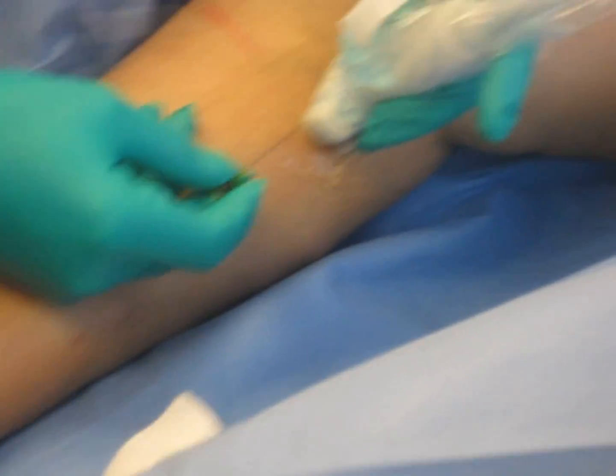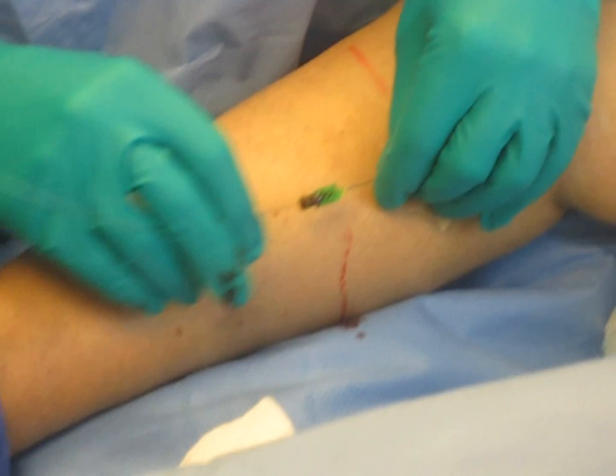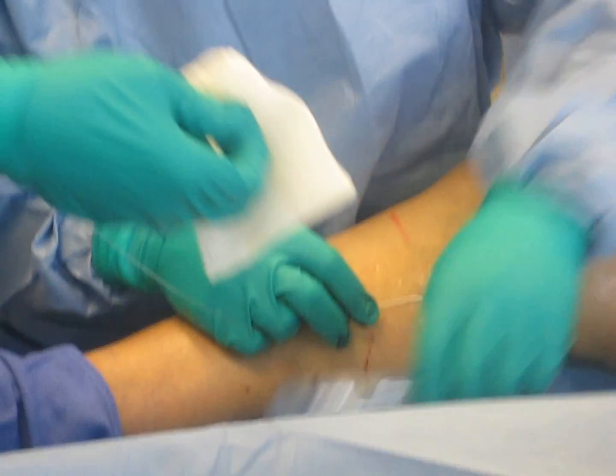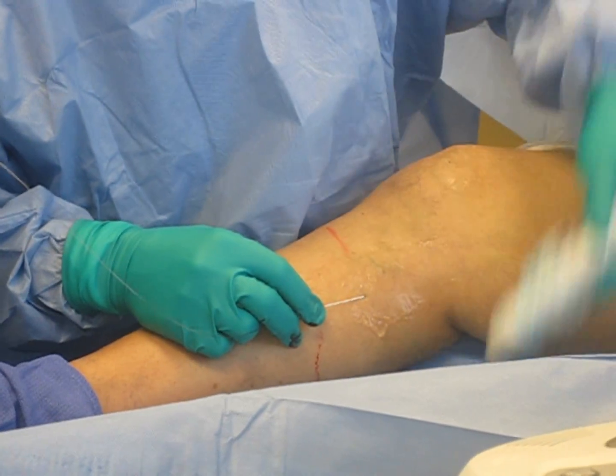On the picture on the screen you can see we've accessed her vein right there — you can see me wiggling the point of the needle. You're going to see the guide wire come out of that needle and we're going to move up the vein. The vein's a little tender. Sometimes when patients have been standing before they come in for the procedure, the vein's a little tender. She might be a little apprehensive too.